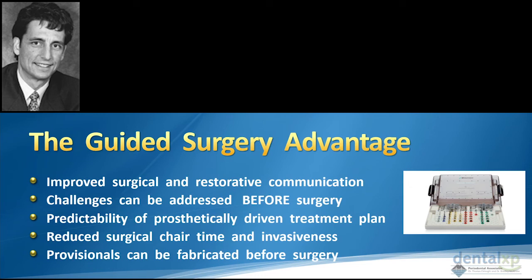Now, one of the things that I've found is that while I would love to do things flapless, most cases come with inadequate bone and inadequate soft tissue. So what that means is I don't get to do as many flapless cases as I would like to do. But when they come along, we'll go ahead and utilize that technology.